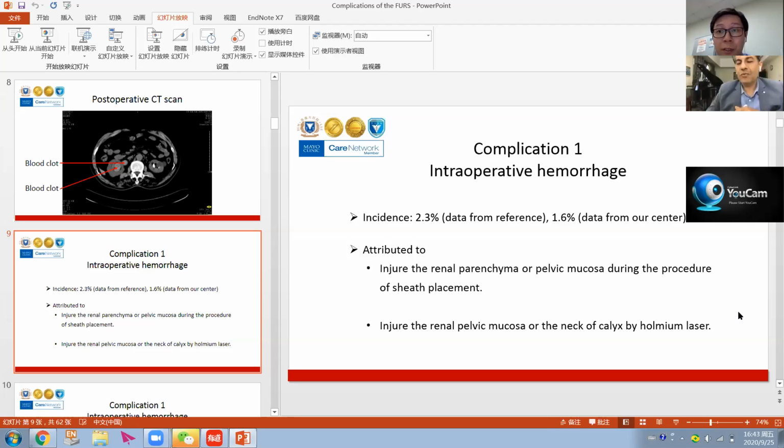Let me comment about this point. For the access sheath, the main concern is the diameter, not the length. The length is a matter of convenience for the surgeon. The main concept is that you have to keep it a few centimeters below the ureteropelvic junction. This allows the flexible scope to be manipulated freely, without affecting the deflection of the scope, and at the same time gives good irrigation and backflow of the water. Whether the surgeon uses the short or long one is a matter of convenience, but the main criterion is to keep it below the pelviureteric junction to allow deflection.